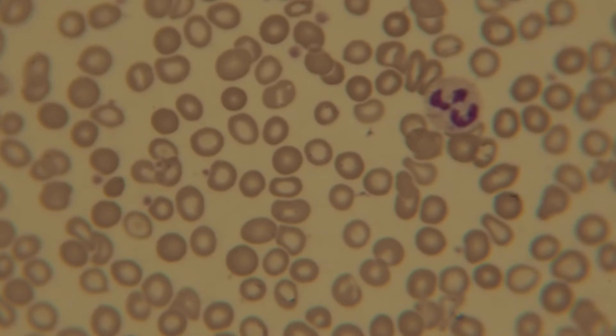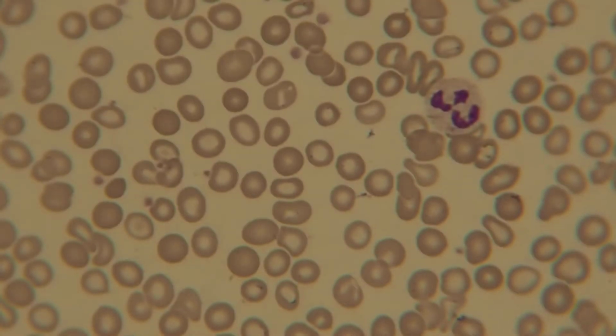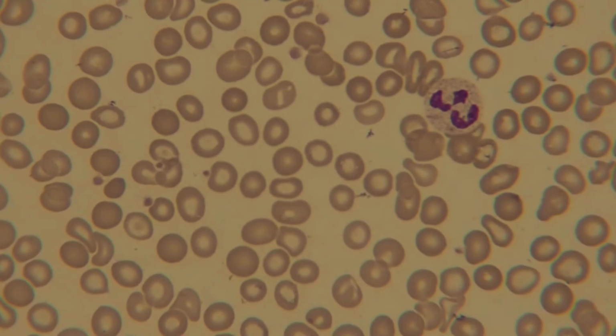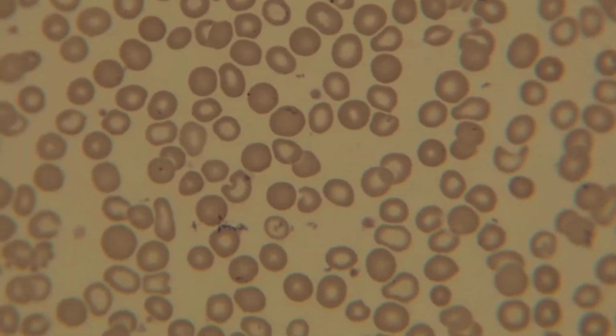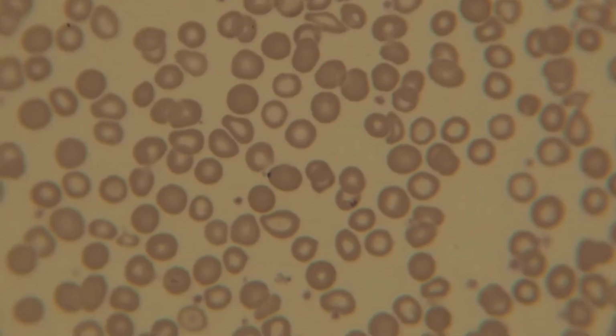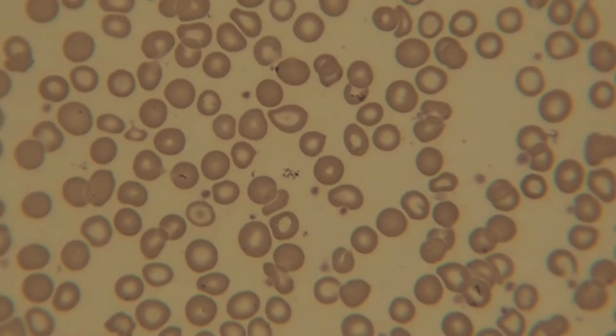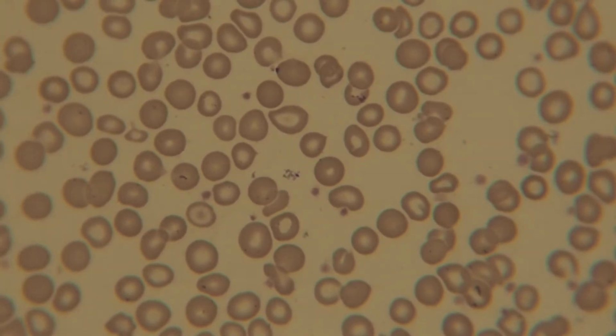I'm also seeing some spherocytosis. Definitely some spherocytosis. Let's keep that in our minds. Yeah, I see target cells again. So I'm actually going to make a notation for target cells. But I'm seeing more spherocytosis.